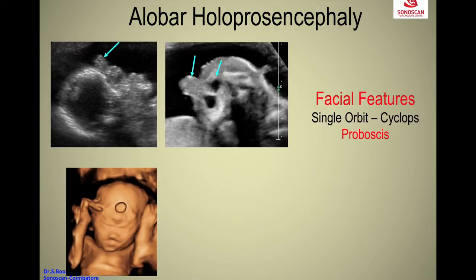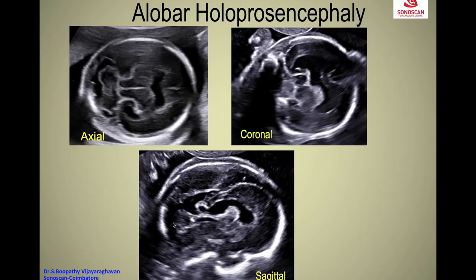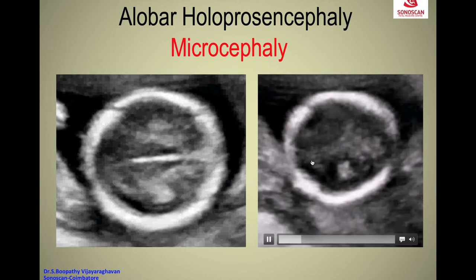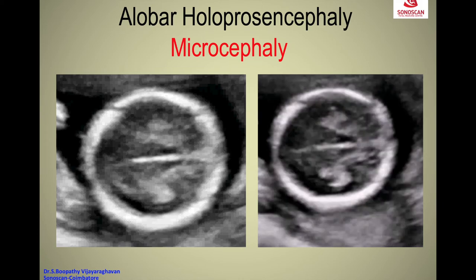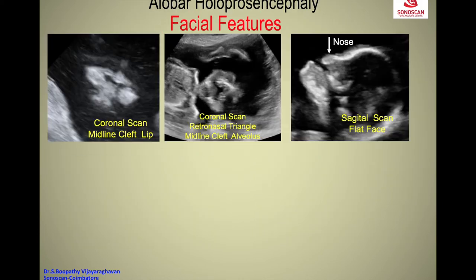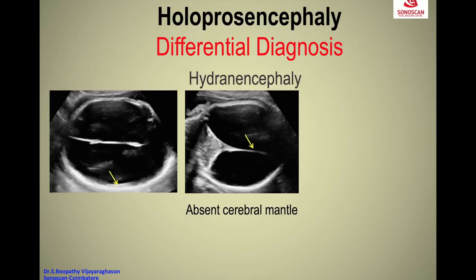If you take a section scan, this is the 3D reconstruction. In the coronal scan of the face you see the mouth, upper lip. Here there is a suggestion of absent CSP but it is not clear. In cephalic presentation, we can see a very flattened, collapsed nose — it may mimic as if there is no nose.